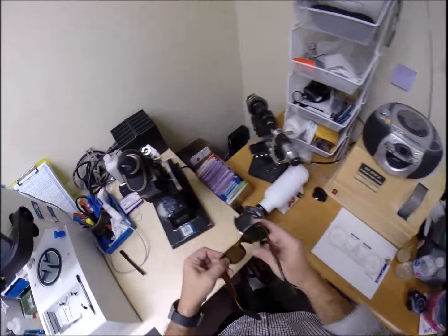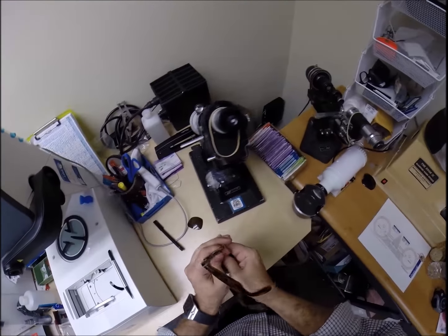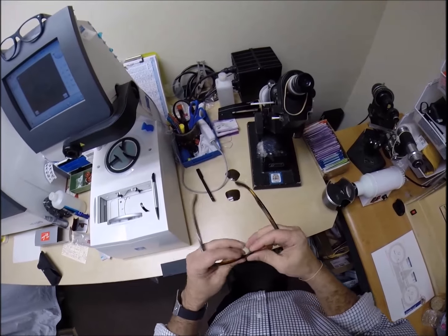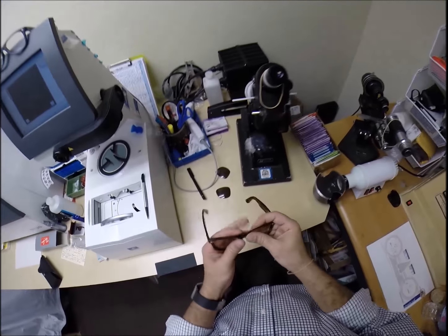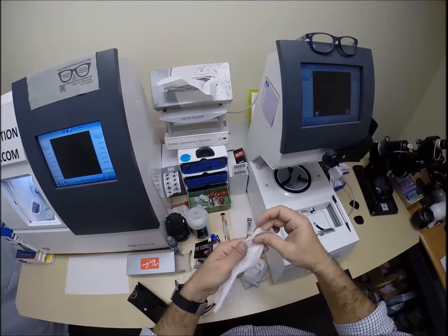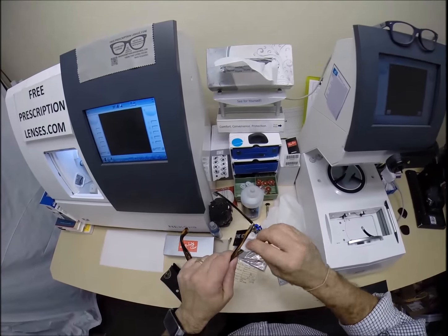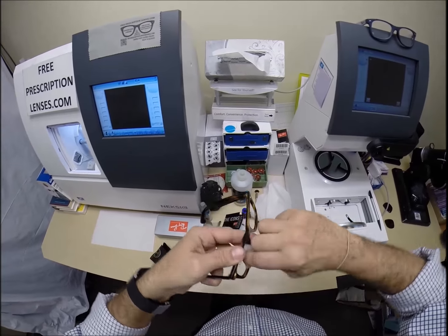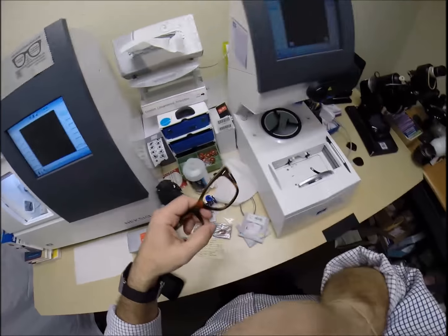So let's see if this has come out. I can barely touch the lenses. There we go, that pops out. Do the same thing for that side. Make sure the frame is still in alignment. Oh yeah, we're good to go. We are good to go. The other thing I like to do is clean the adhesive off the inside of the frame where the lenses are. There's a little bit of glue residue. That's why it's a little bit tough getting out. Plus it has a deep bevel. I'm probably going to have to take the lens down a few sizes to get it to fit well.